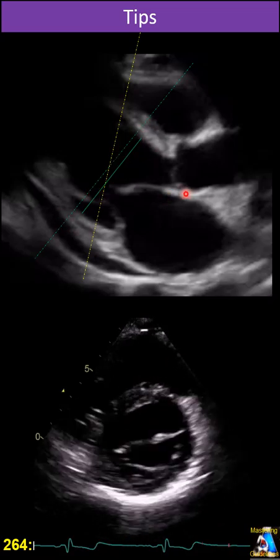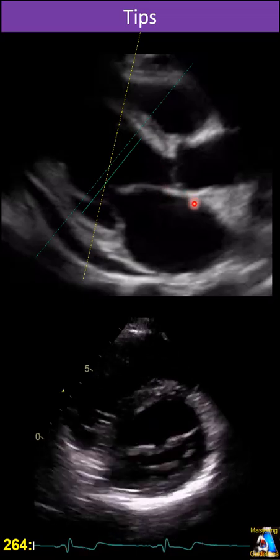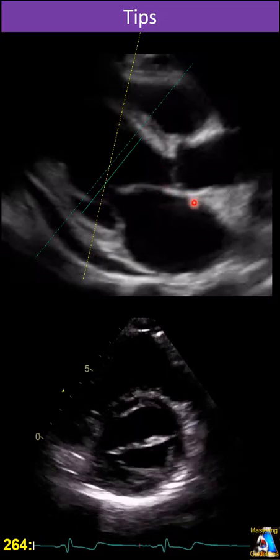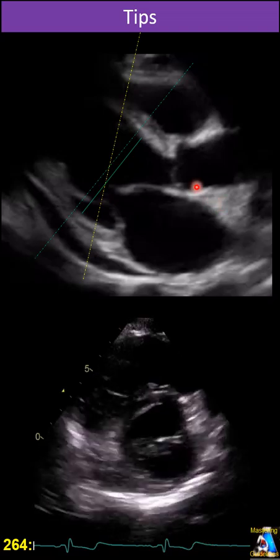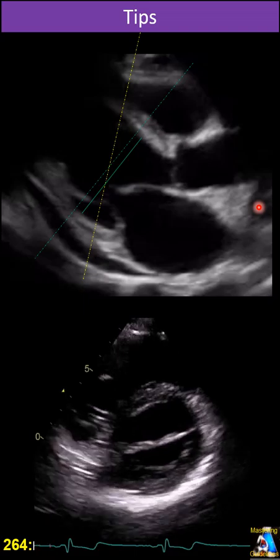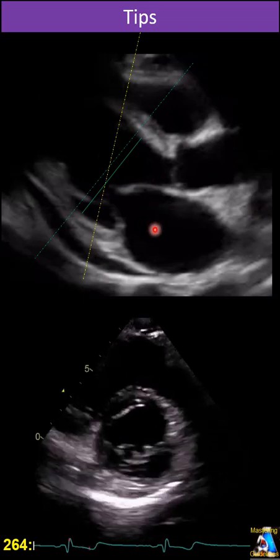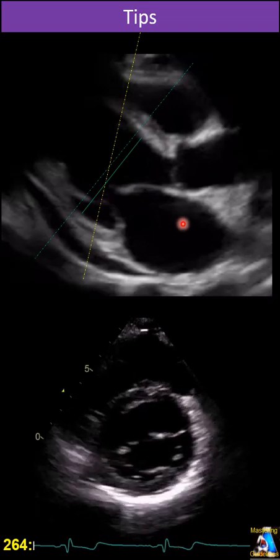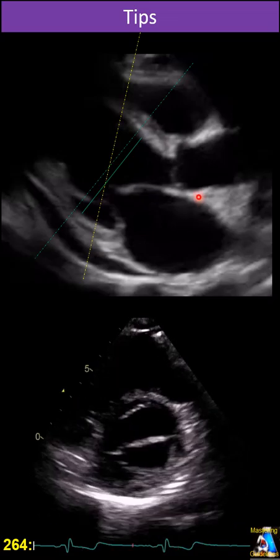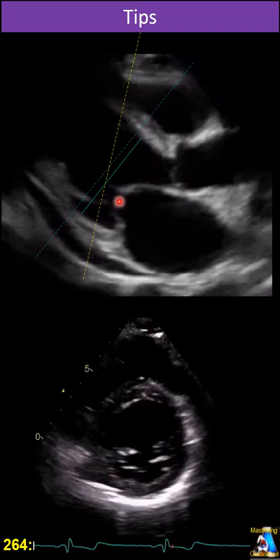systole. The most important part of doing systolic measurements: most of the time systolic will be off axis. The very simple reason is that the heart shakes left and right a little and moves. So during diastole and systole, our cross section will not be the same. That is the reason I usually don't recommend measuring systolic.